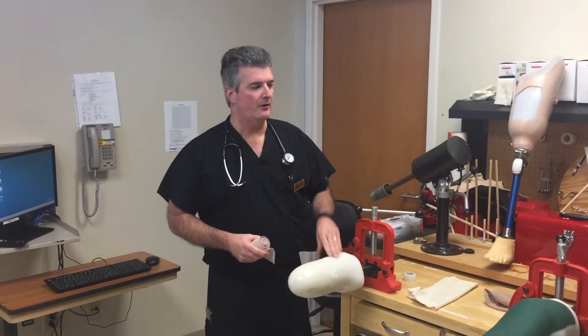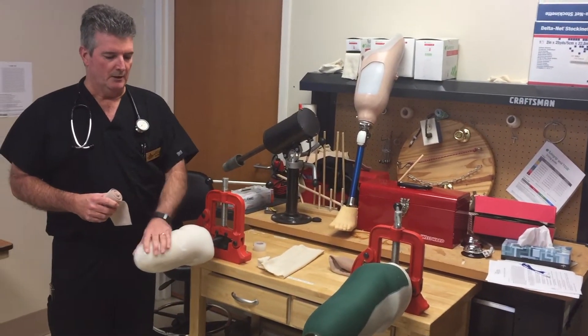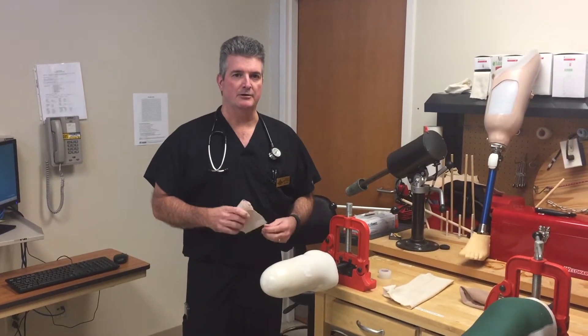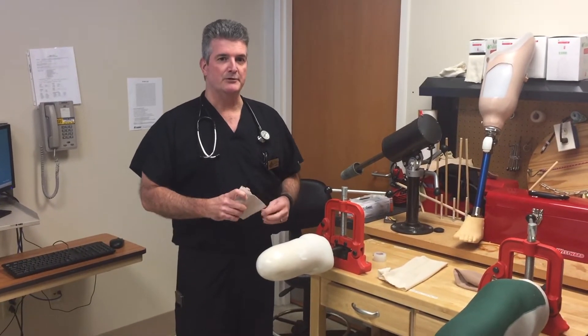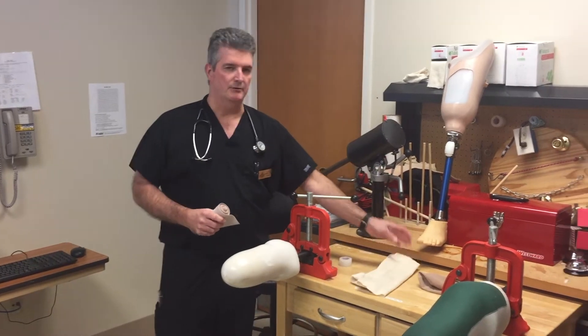We have our simulator lab as well as our prosthetics lab, and we do nursing training in here as well as teach our patients how to do their own stump wrapping. I want to demonstrate the difference between doing a figure-eight H-wrap versus using tuba grip and the speed at which you can do this.